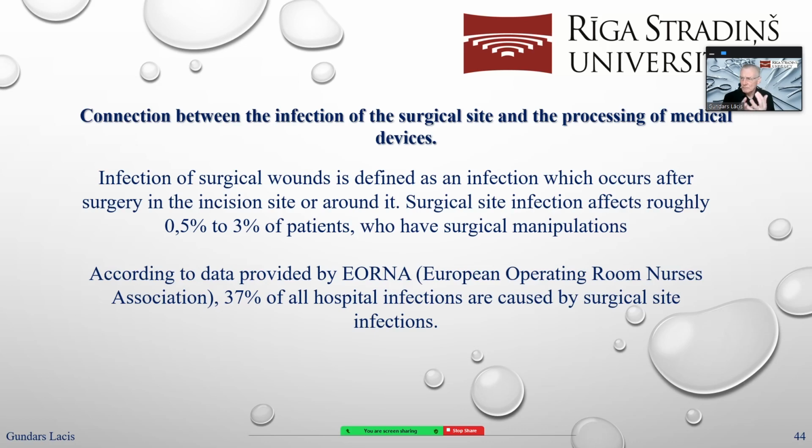Here there are different possible reasons. It can be a dirty team, dirty environment around, dirty equipment, dirty instruments, transportation ways after surgery to the department, and of course care in the department.